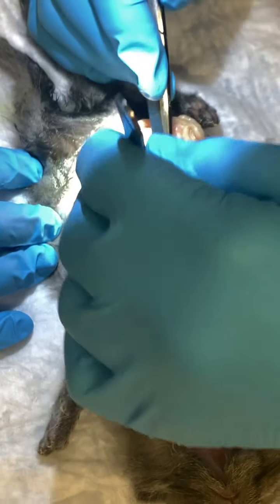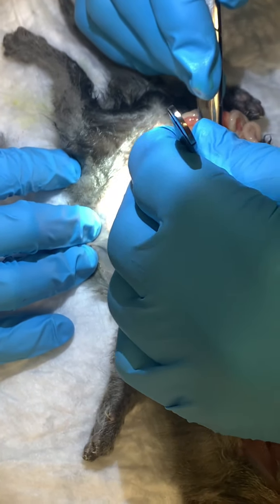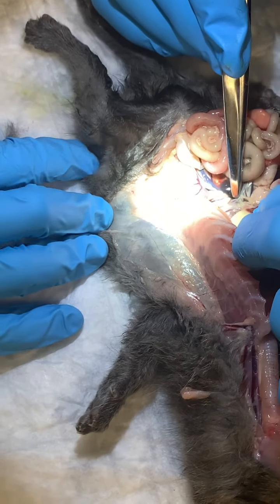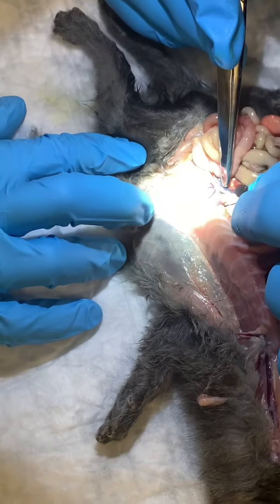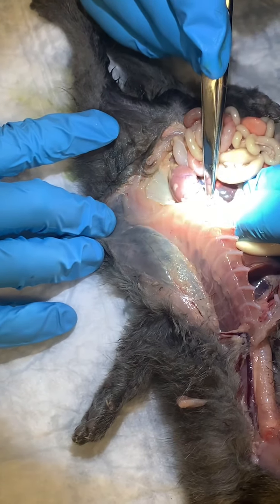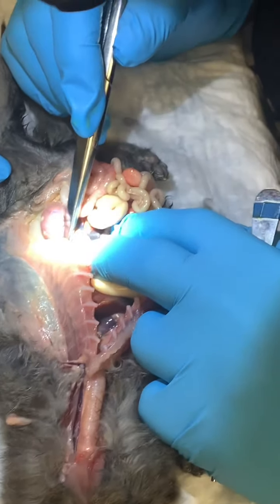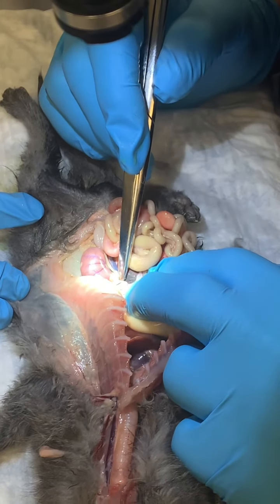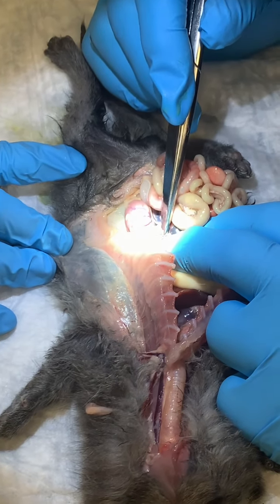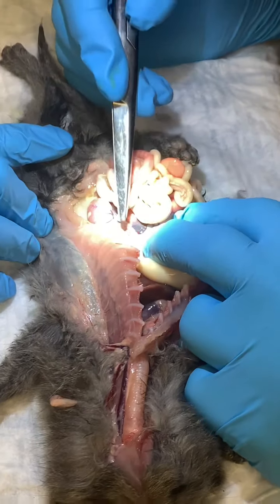And then the pancreas wraps around over to here. It's kind of weird. I don't know if that is pancreas.